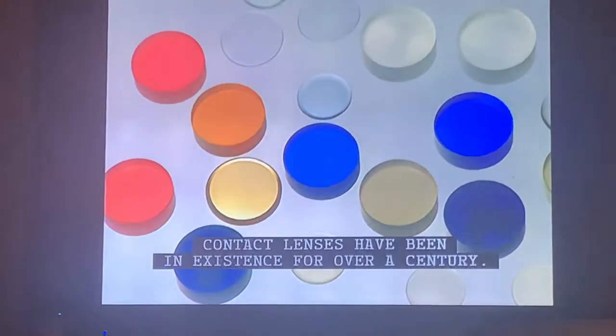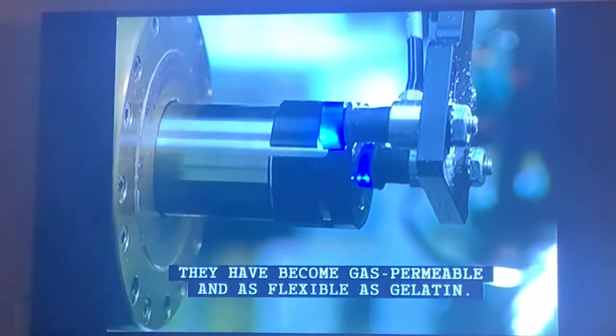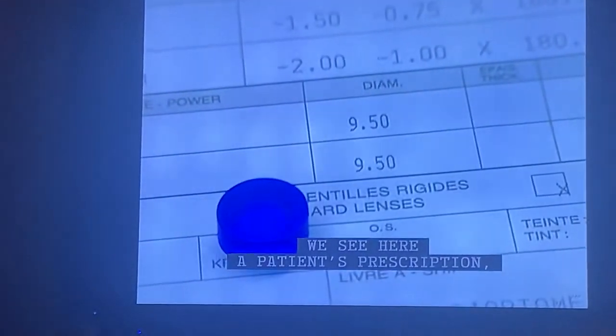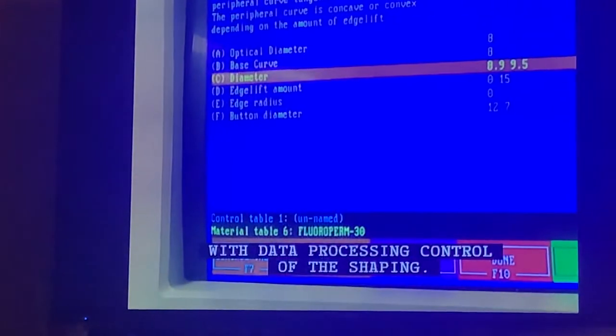Contact lenses have been in existence for over a century. At first completely rigid, they have become gas permeable and as flexible as gelatin. These small polymer discs are used to make soft polymer contact lenses in a variety of colors. We see here a patient's prescription, essential to the fabrication of lenses, where the process begins with data processing.